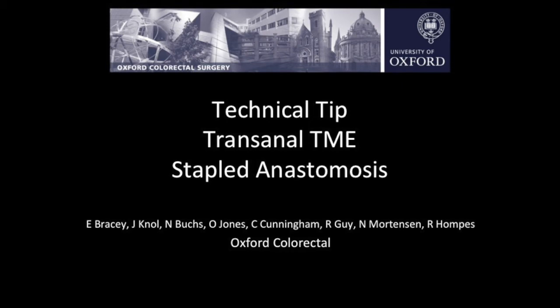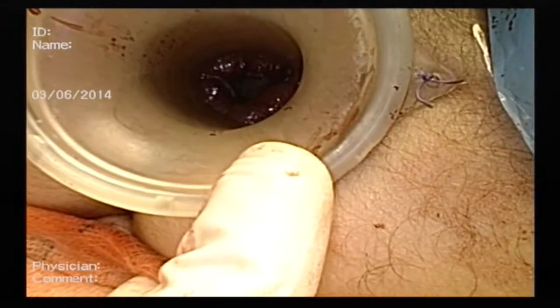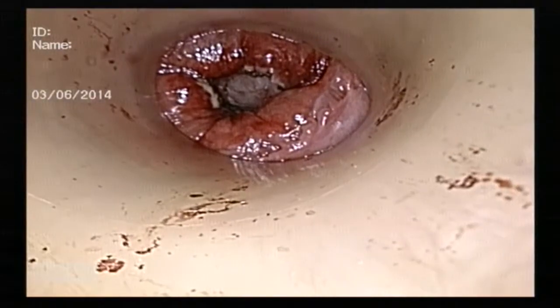This is a technical tip on how to perform a stapled anastomosis following trans-anal total mesorectal excision. Following a trans-anal total mesorectal excision, the distal rectal cuff is viewed through the anal port.